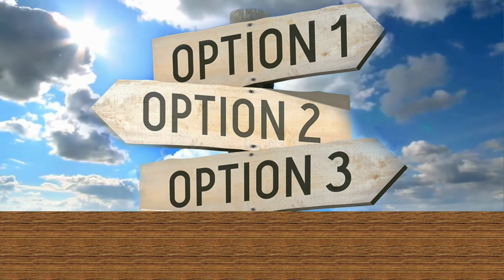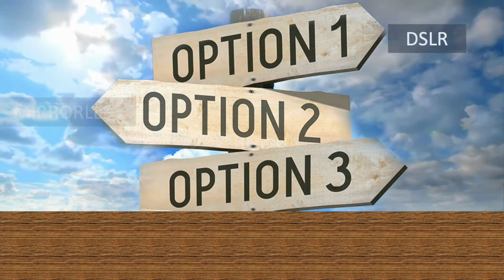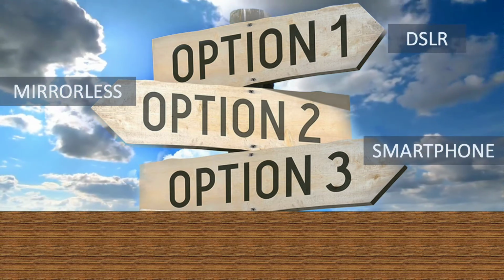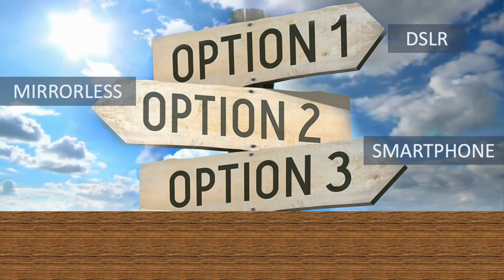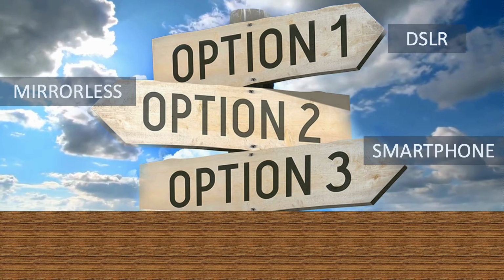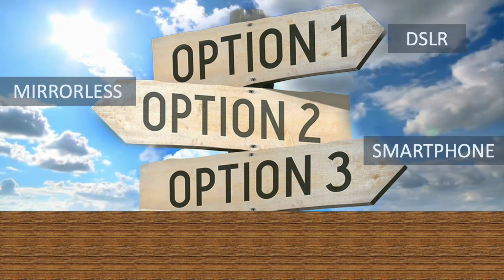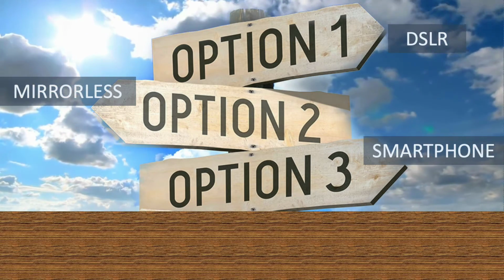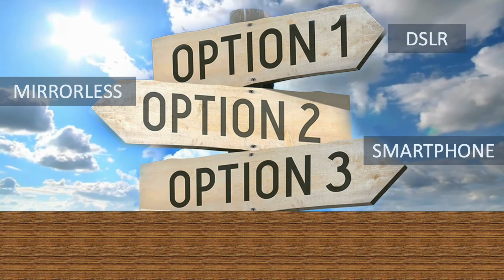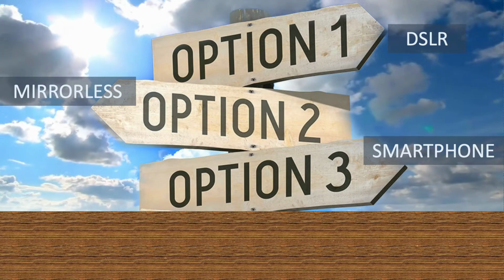The alternatives to DSLR are mirrorless cameras and smartphones. Previously, mirrorless cameras and smartphones had poorer images due to their smaller sensor size. Thanks to evolutionary advancement in sensor technology and image processing, the clinical images produced by these alternatives are comparable to DSLR, as reported by Shahrol in 2021.